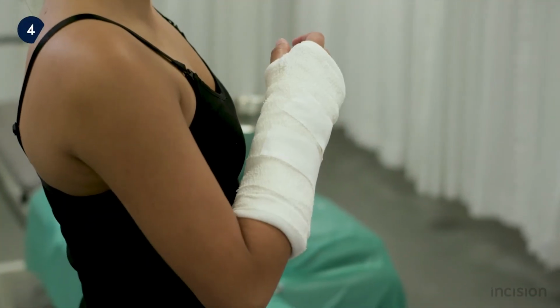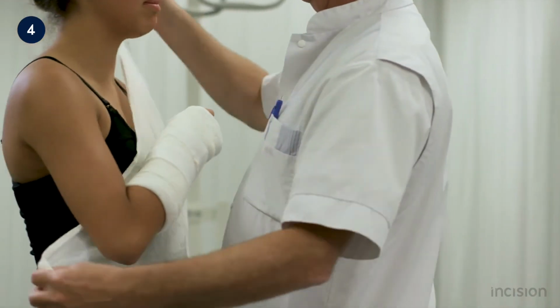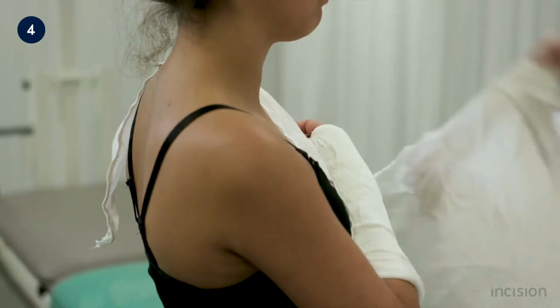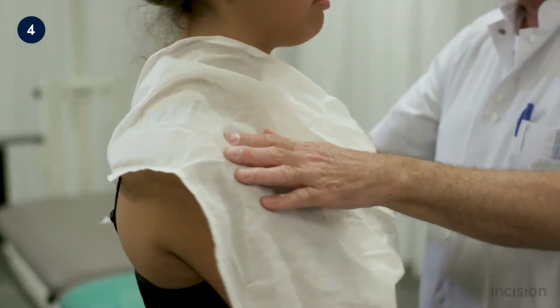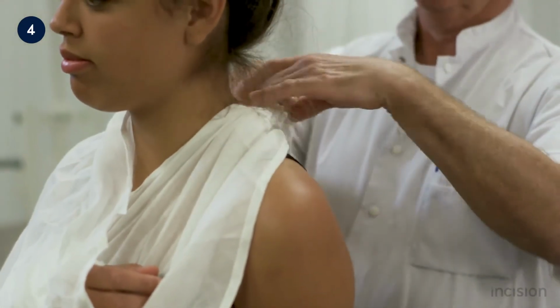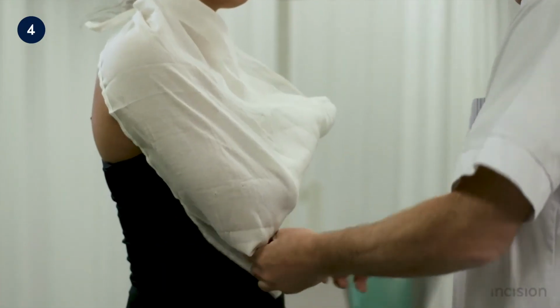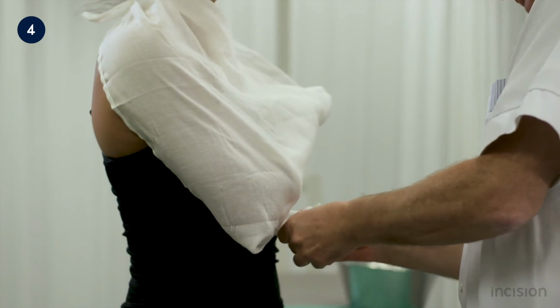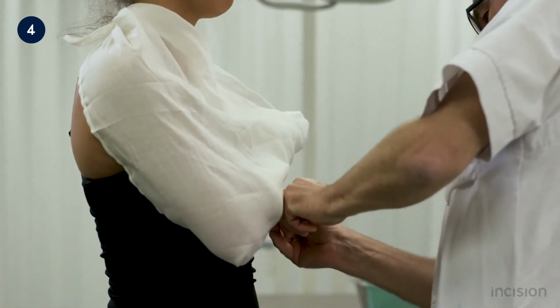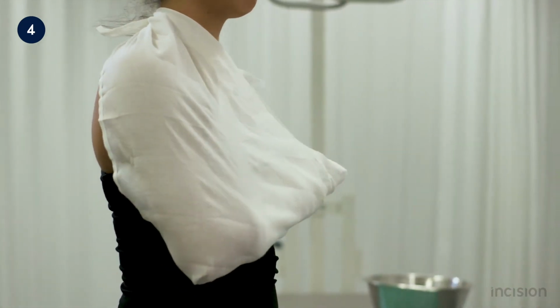A triangular bandage is used to immobilize the arm. The longest side is positioned over the shoulder of the unaffected arm. The other side is positioned over the shoulder of the affected arm. A reef knot is used to fixate the triangular bandage. A safety pin is used to attach the triangular bandage to itself, making sure to support the elbow. This finishes the application of the triangular bandage.